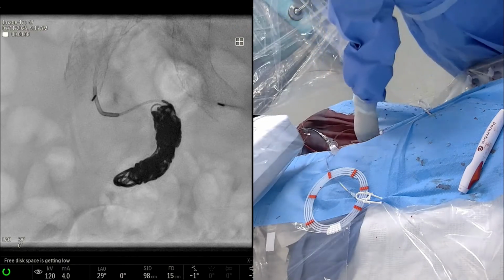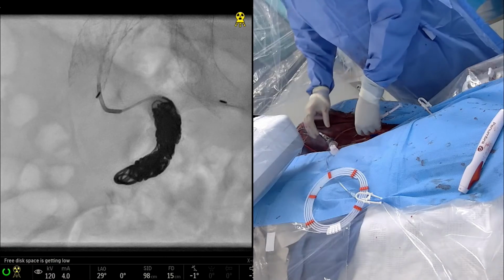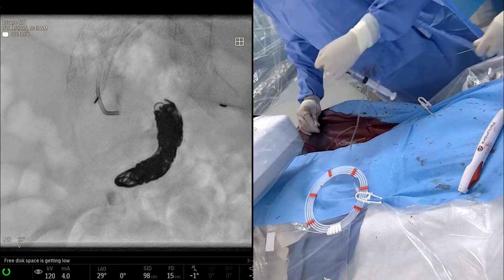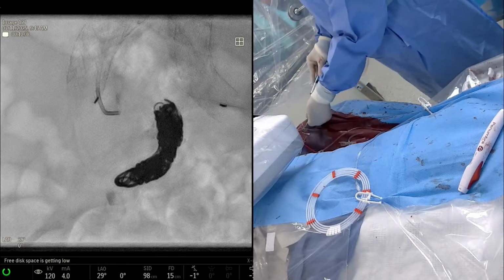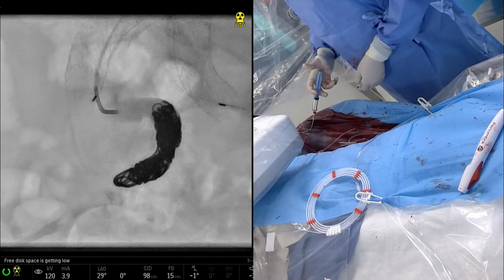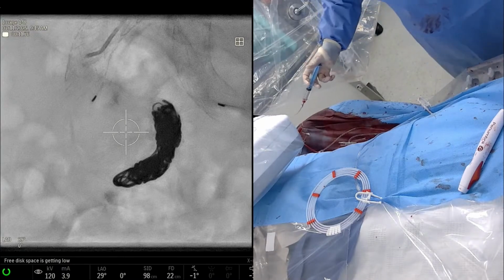That was sailing. Very nice. Now it's done, right? Wow. That was injecting through the microcatheter. So you're not even injecting space, and you can see it's kind of sluggish to and fro, kind of bobbing back and forth like before. I don't see that now. Less so for sure. That's closed, right? I think you're done. We'll put that stent graft in, you're done. That's awesome.